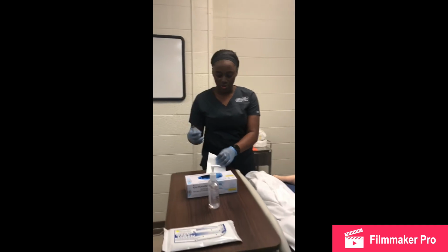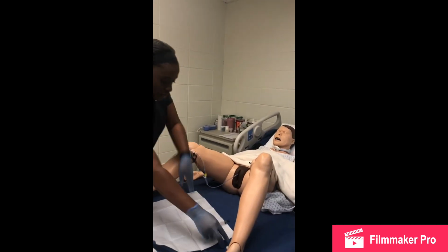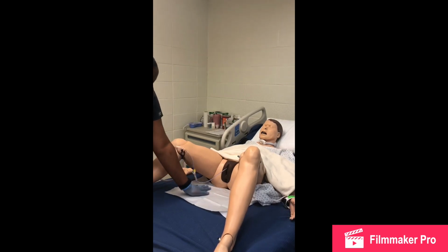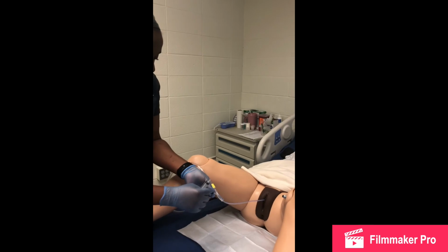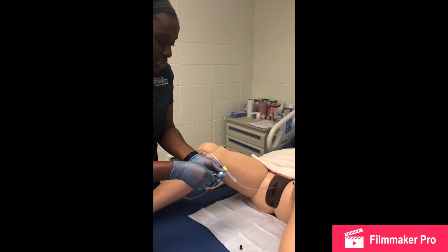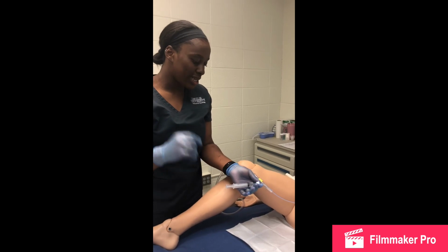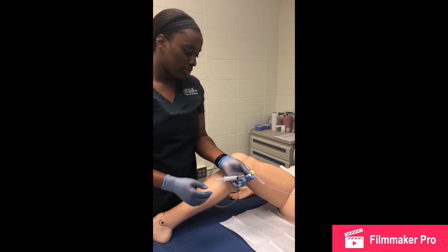I have my syringe and I have my absorbent pad. I'm going to carefully place it underneath my patient. Then I'm going to attach my syringe to my Foley and let gravity pull out all the fluid. When inserting the Foley, we documented that it was 10 cc's inserted, and we should get 10 cc's back.